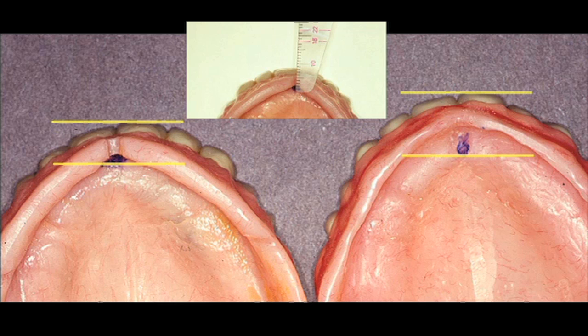The denture on the right now, if we took the position from the incisal papilla and measured it to where the maxillary anterior teeth are, we have about 12 to 13 millimeters. What this does for our patient facially is that it will begin to reduce those wrinkles above on our maxillary lip. We'll be able to fill out those nasolabial folds slightly to give our patient a more youthful appearance.